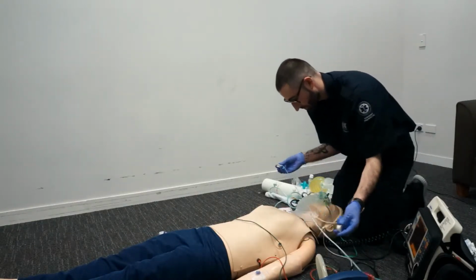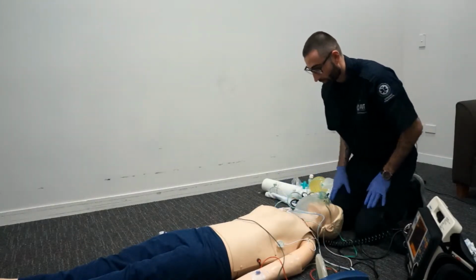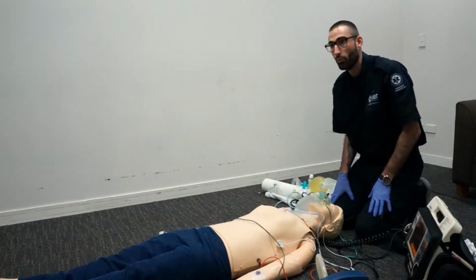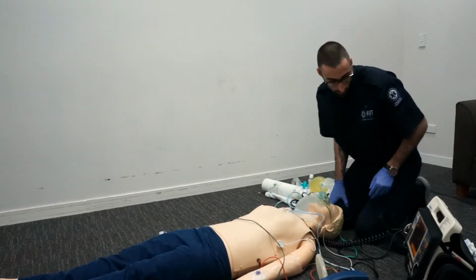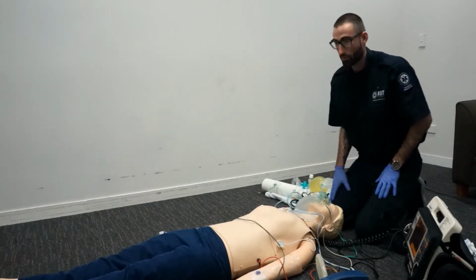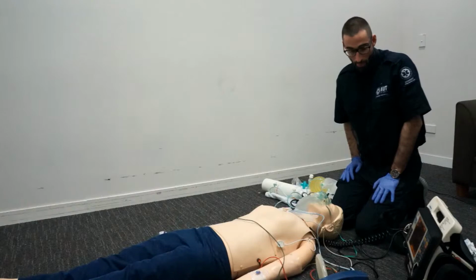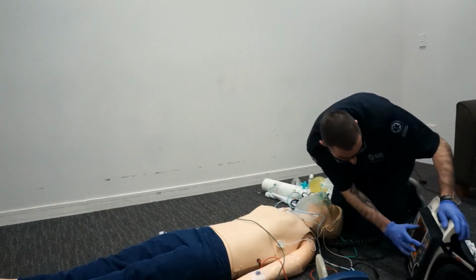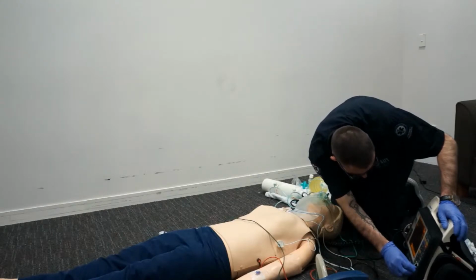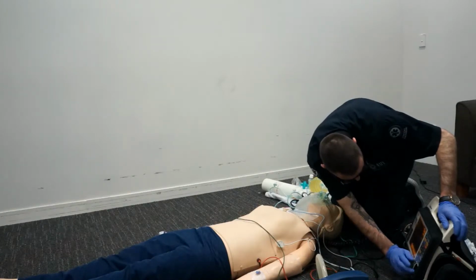Okay, so I'm attaching the pads here. We have our 12 lead already on, as we've got that on before. Ensure the defibrillator is in manual mode. Okay, we've got it on manual mode. We put it into manual mode before. Select a lead with a visible R wave and ensure that artifact is minimized. Okay, selecting lead. Looks like lead 2 has good visible R waves, and there's a little artifact.